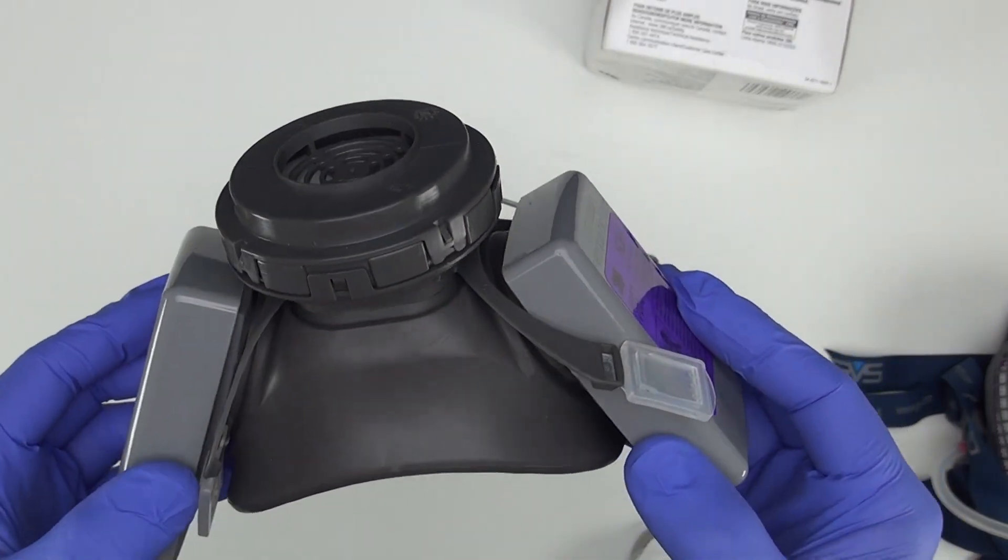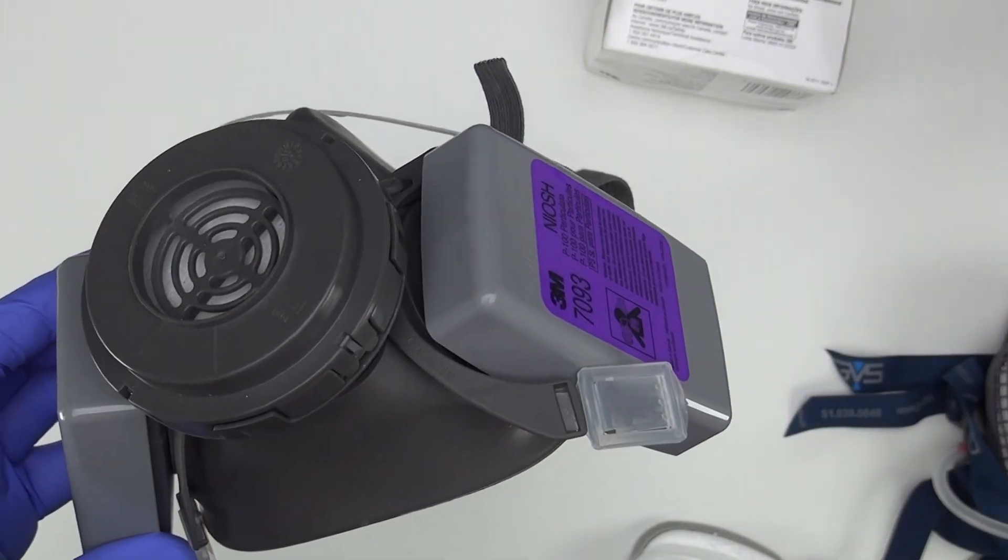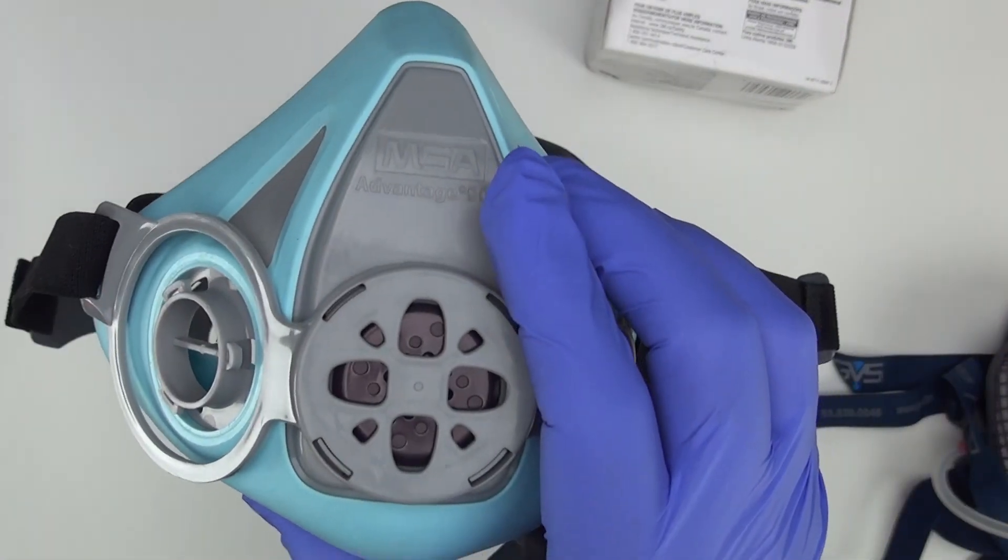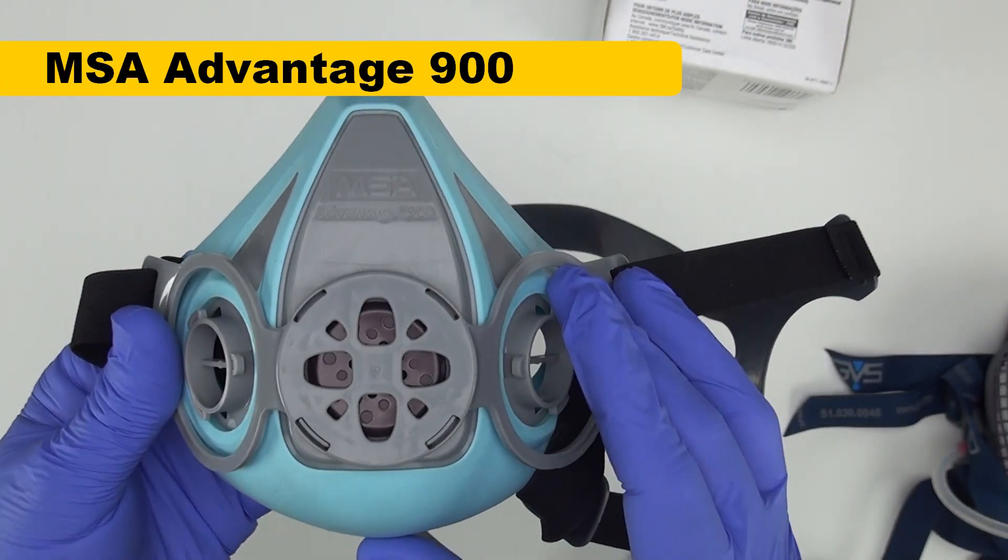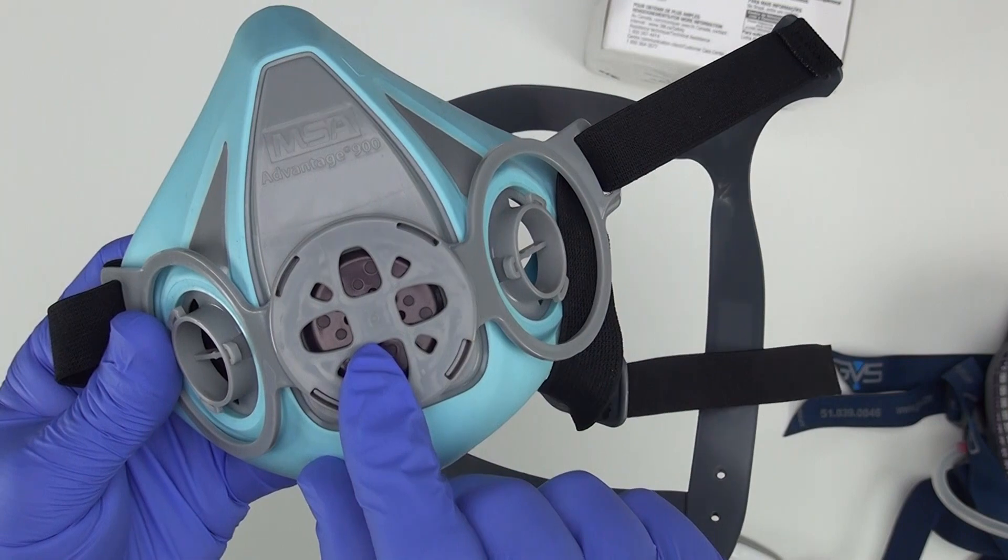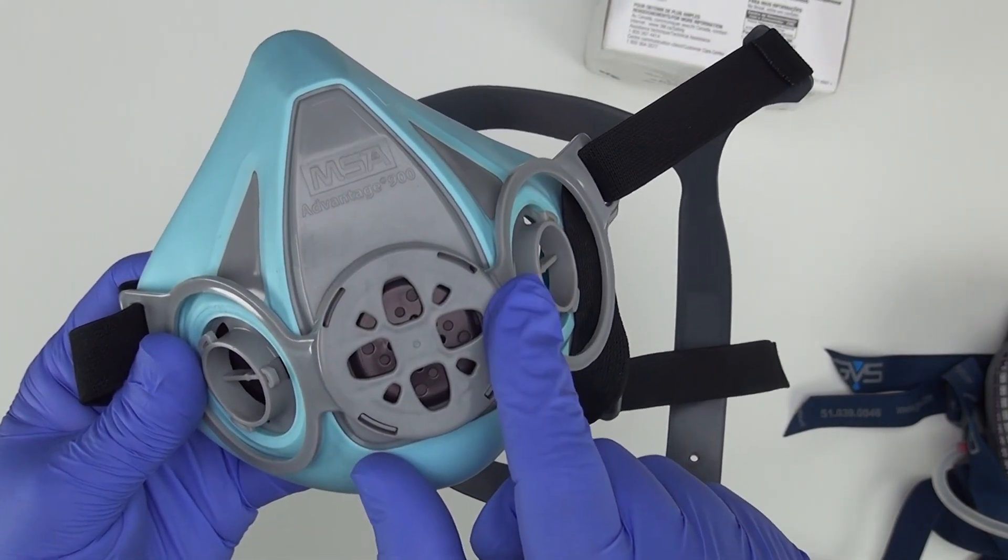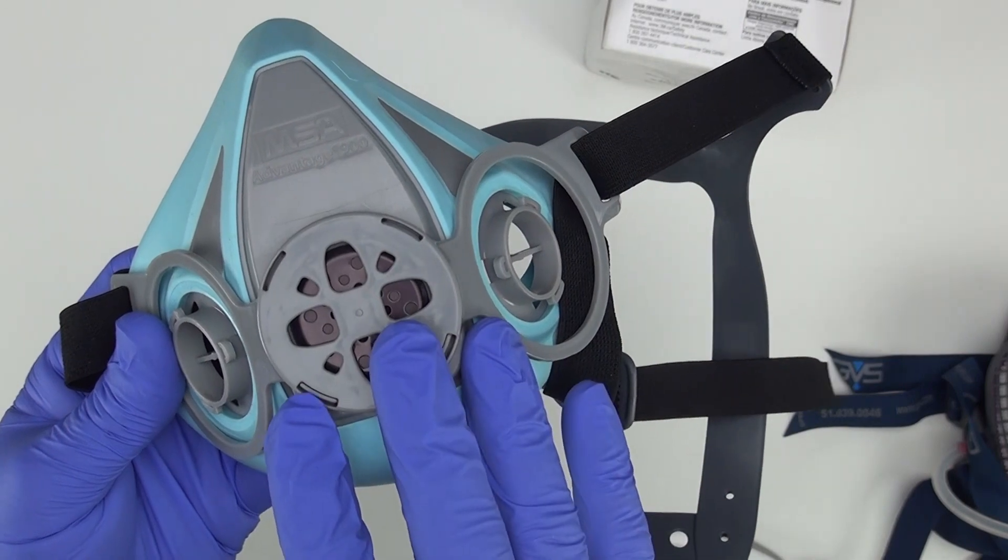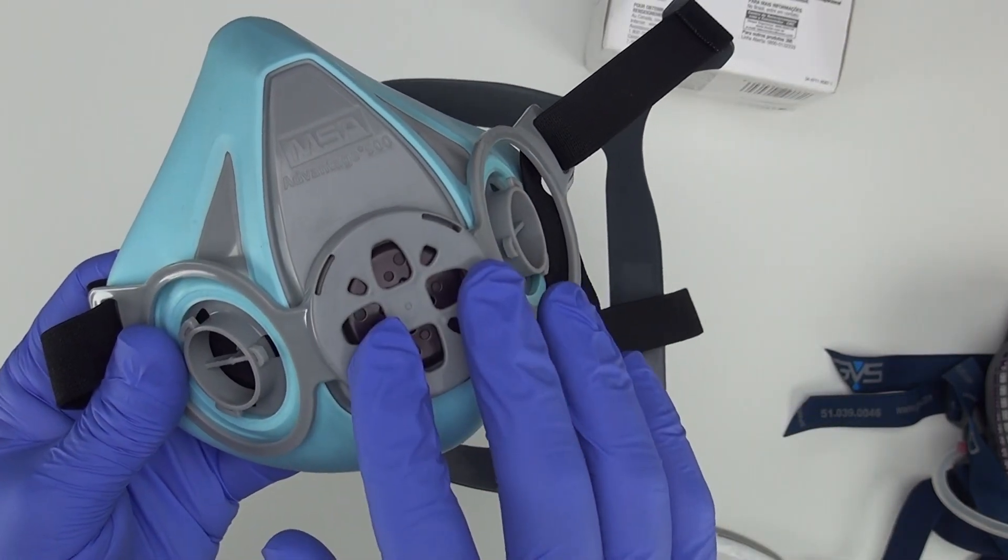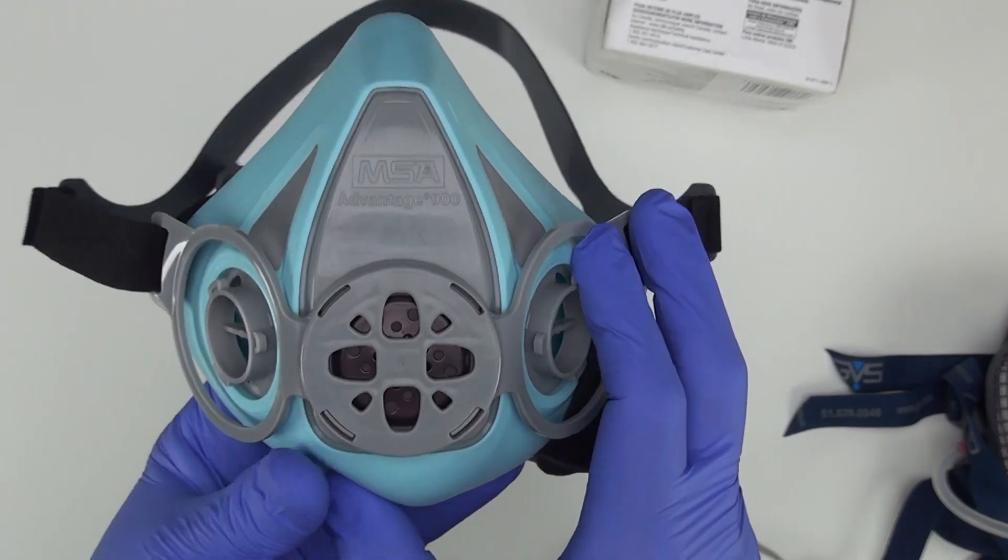There's another source control mask that's NIOSH approved that you can get. And it's got a unique feature that these other masks don't have. This is the MSA Advantage 900 mask. And it has a little speech diaphragm. It goes right where the valve used to be in older models of the mask. That lets you be more intelligible. And it doesn't let any air out. It's something that a lot more masks could use. And I wish 3M would add one.